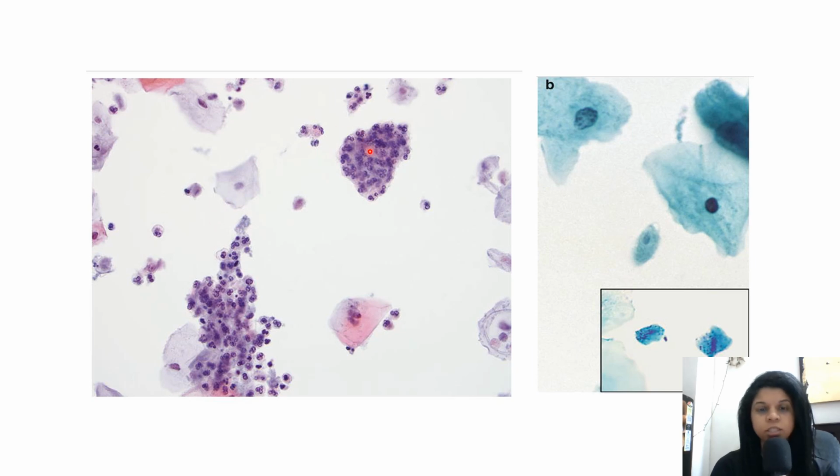And then here you can see the polyballs, or the neutrophilic aggregates that form in the smear, which is again a clue for trichomonas. And in the LBC slide, you may see the pear-shaped organism and the flagella very properly, and then you can see the granules present in the cytoplasm of the trichomonas. So these clues you should also remember, like polyballs, clinging of the organism to the epithelial cells, etc.